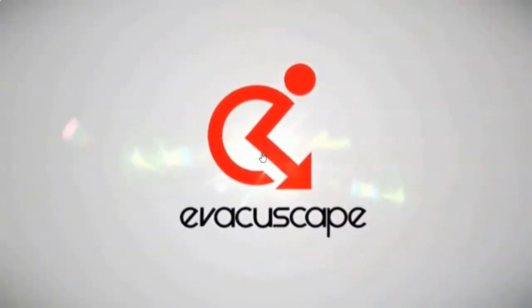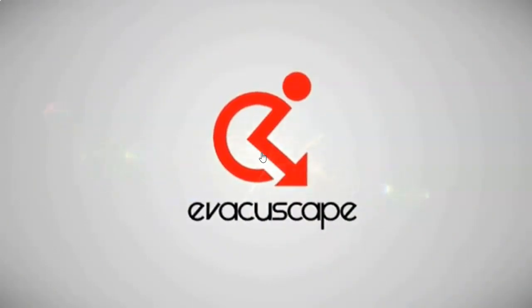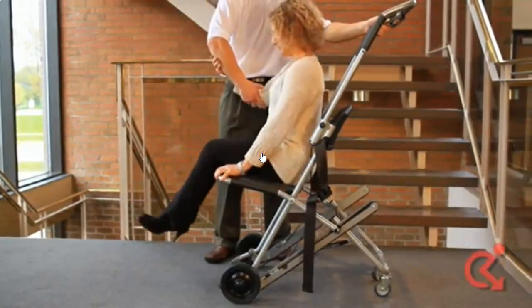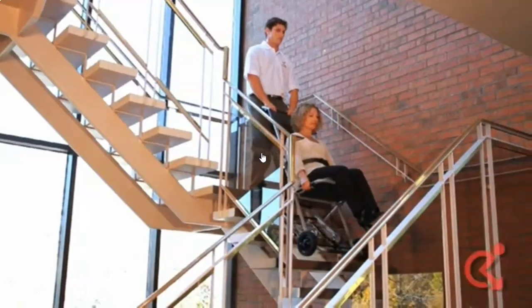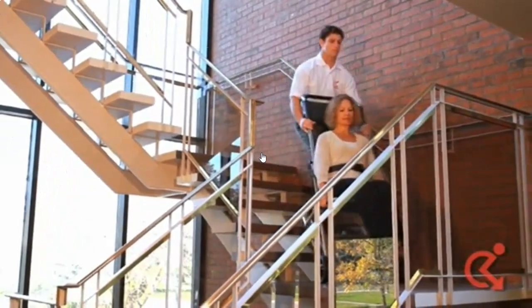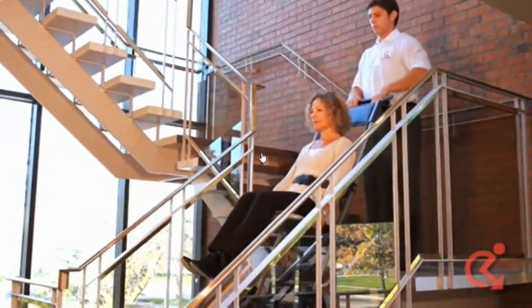This video will explain how to properly carry out an evacuation using the Evacuscape chair. Practicing evacuation drills regularly is necessary to ensure everyone knows their part in the event of an emergency. The Evacuscape chair is specifically designed to allow an individual to transport a person quickly and safely downstairs during an evacuation.